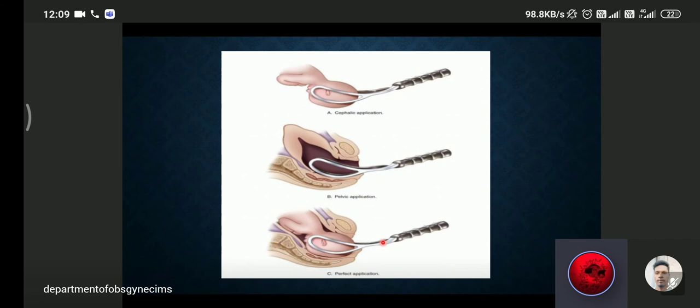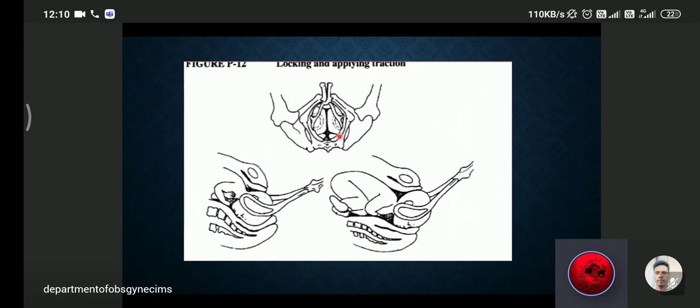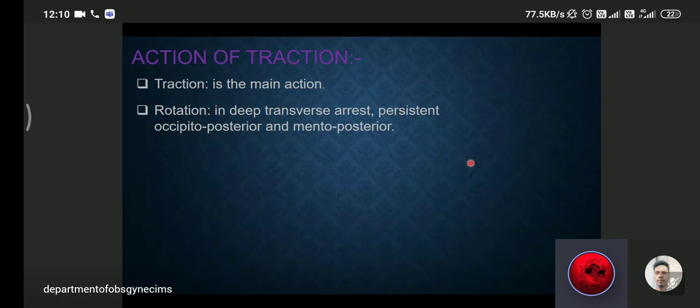After application of the forceps, the lock should be locked. Then we have to pull the head straight horizontal, then upward direction, and then forward direction to make the head visible and then the head comes out from the pelvis. The main action is traction, and rotation in deep transverse arrest, persistent occipital posterior and mento-posterior position only. There is rotation also.